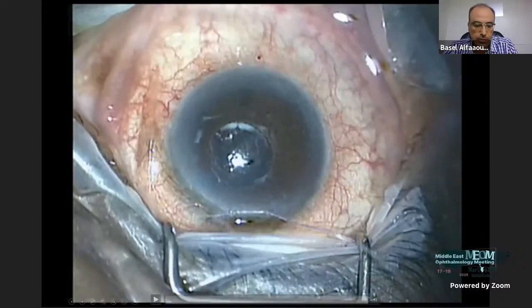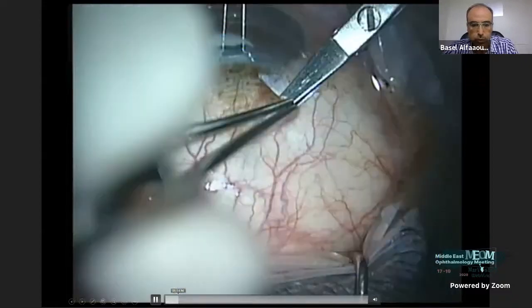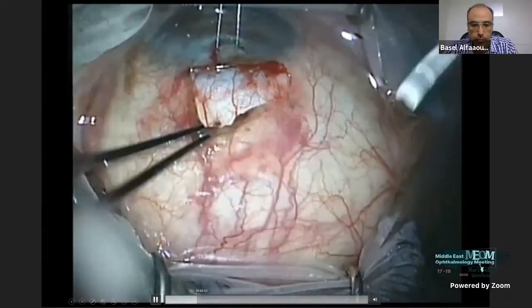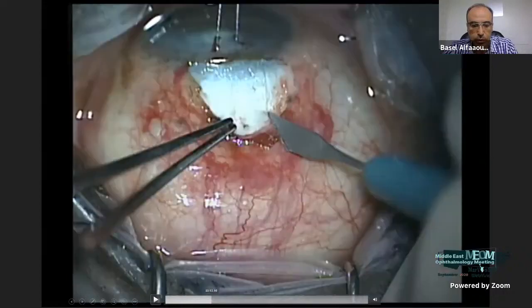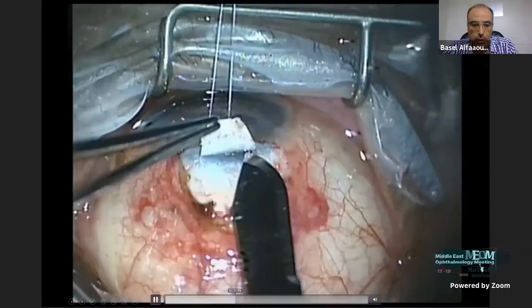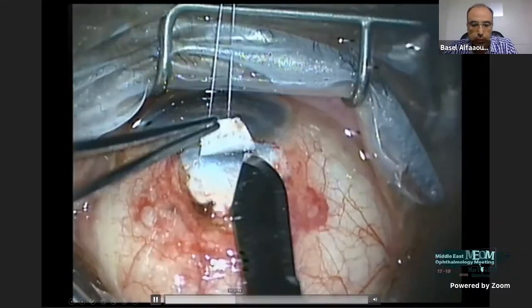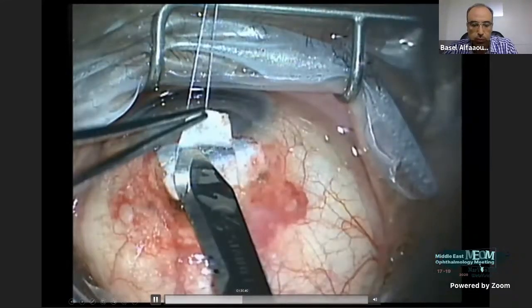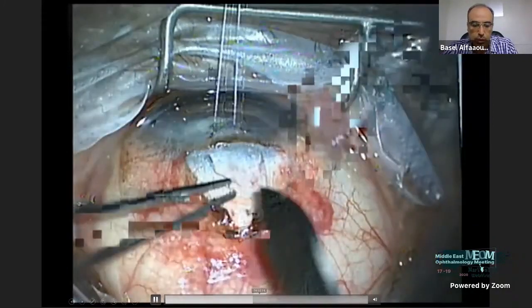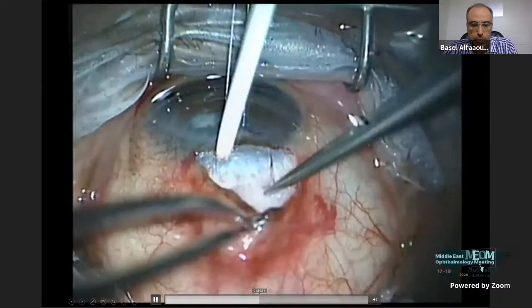It is a video for this procedure. Quickly, we will go over the most important steps after conjunctival dissection. We are doing the flap, 4x4 millimeters. After doing the flap, we can apply mitomycin, the same as in traditional trabeculectomy or deep sclerectomy.